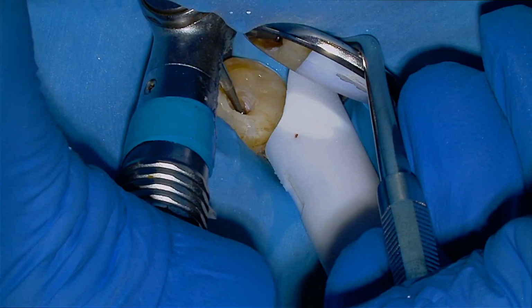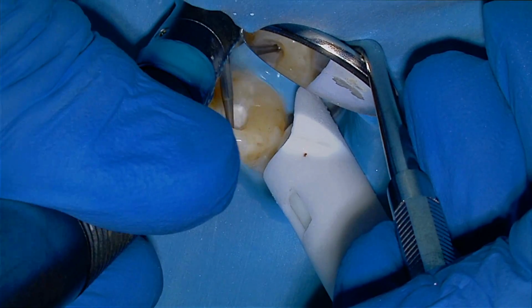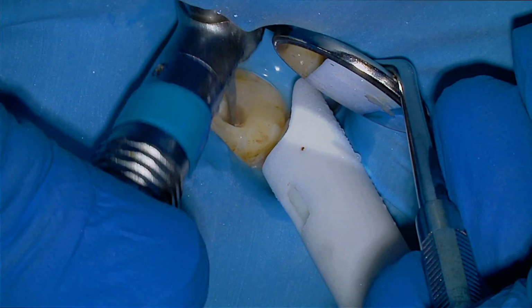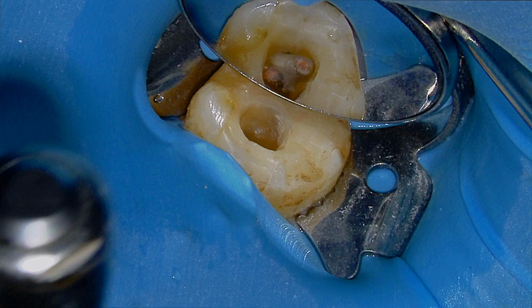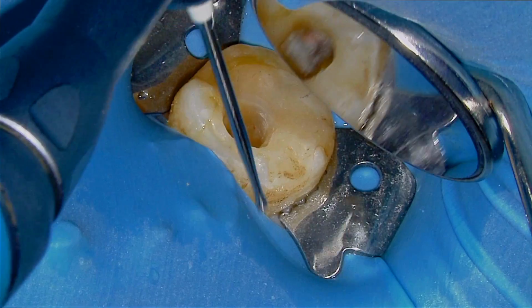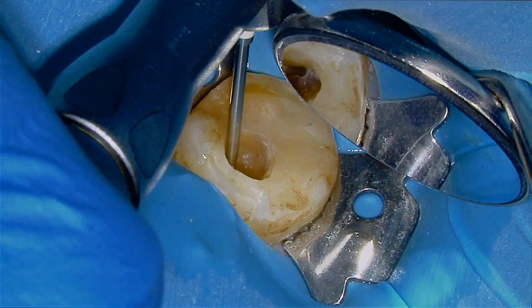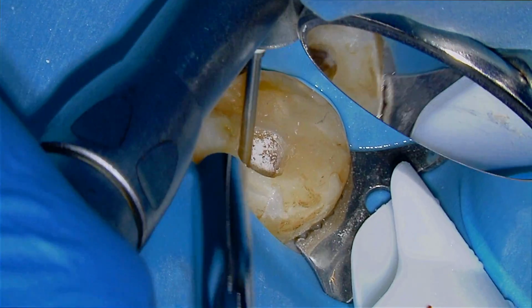And now I'm just going to, it's always that mesial buccal corner that seems to always be the difficult little corner to get under. So we're going to use our burr to remove some of that composite from the area, and now you can start to see where the top of the gutta percha is, the orifice. So I'm going to slow it down and use a Muntz burr, which is essentially a long shank round burr, and slowly remove all the composite.